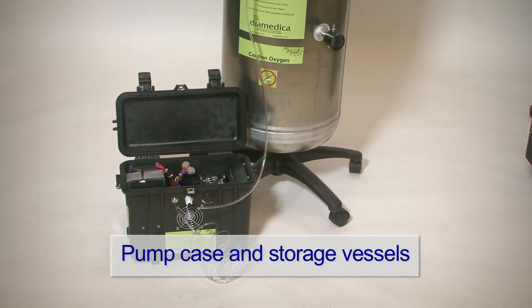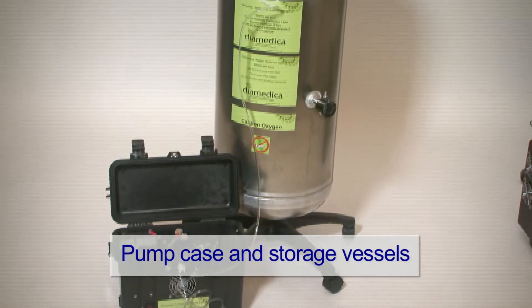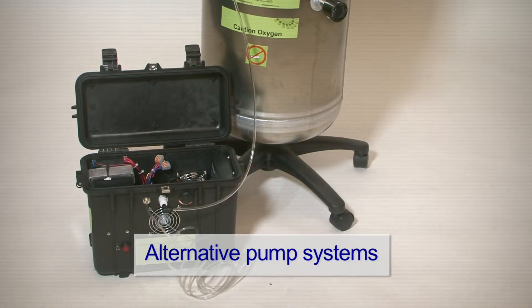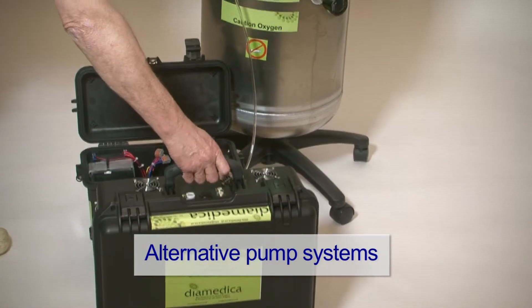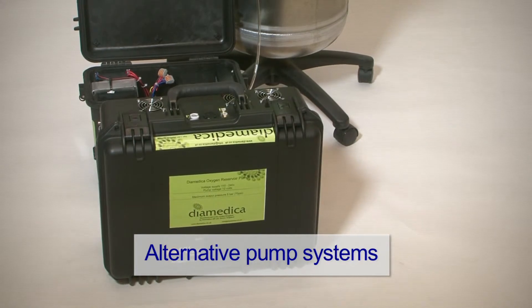The product consists of a case containing a pump system and a wheeled aluminium storage vessel. There are two versions of the pump system: a standard version with an incorporated battery and charger, and a high duty cycle version using a military specification power supply.